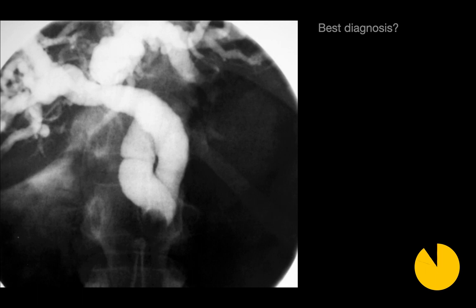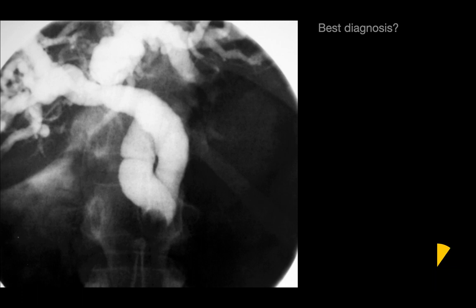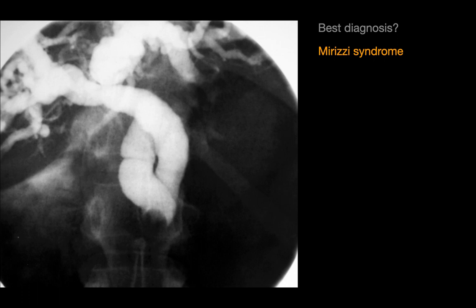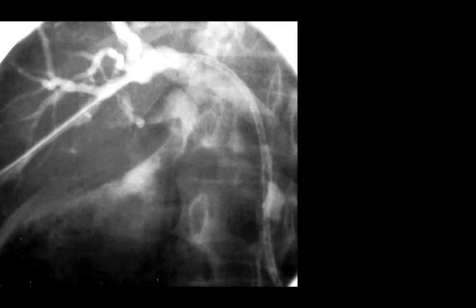The best diagnosis for this case is Mirizzi syndrome: common duct obstruction caused by extrinsic compression from an impacted stone in the cystic duct or sometimes the infundibulum of the gallbladder. Patients with Mirizzi syndrome can present with jaundice, right upper quadrant pain, and fever. In this case, it was managed by interventional radiology with a percutaneous biliary drain.